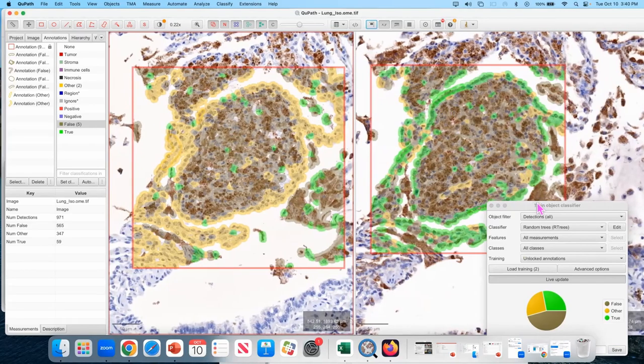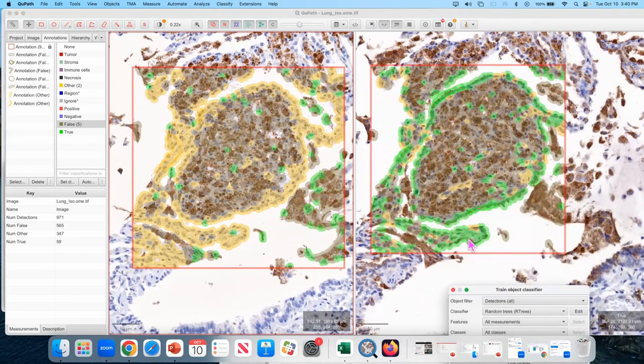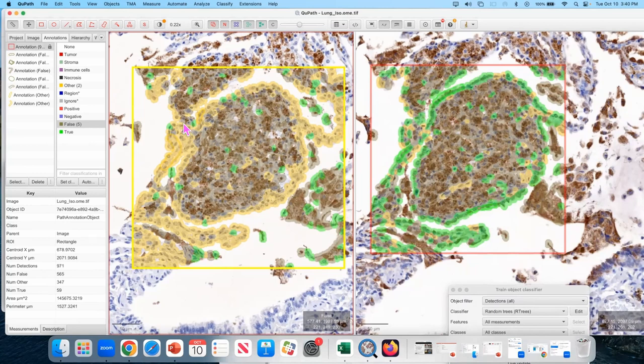So I think I'm pretty happy with this classifier as it is right now. Having a control is amazing, right? Because it allows you to retest your image analysis pipeline and see if it's really doing what it's supposed to do. So now in the isotype control, I have 971 detections, and 60 out of them are classified as true. So there's still some space for improvement.